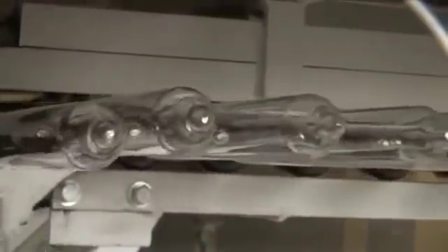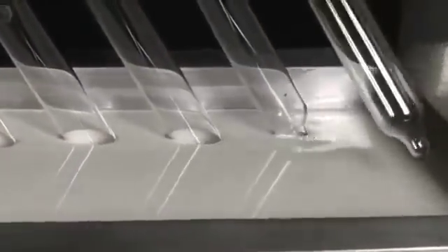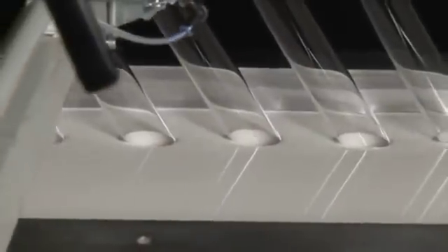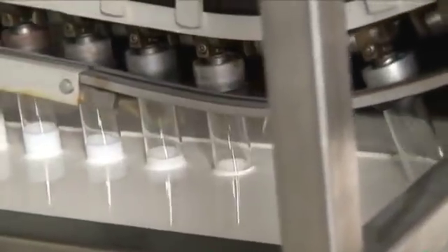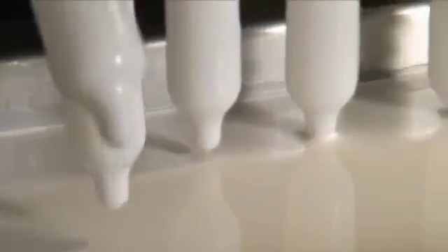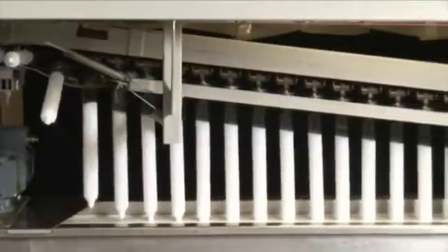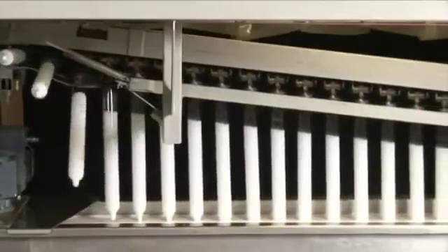Rotating glass formers are fastened to a computer-monitored endless chain. In the initial phase, these glass formers are cleaned and dried before they are immersed for the first dipping process. They are slowly immersed into the latex mixture and equally carefully come out of the dipping tank again. In this step, it is important that the latex film gets an even and wafer-thin strength.